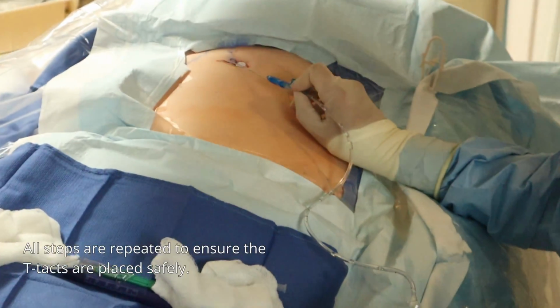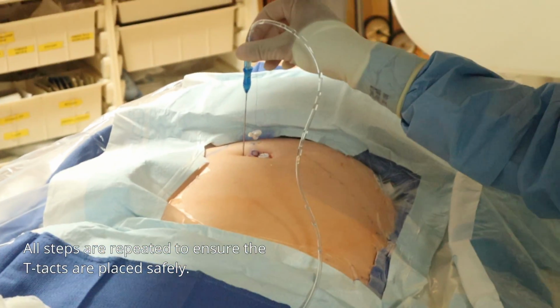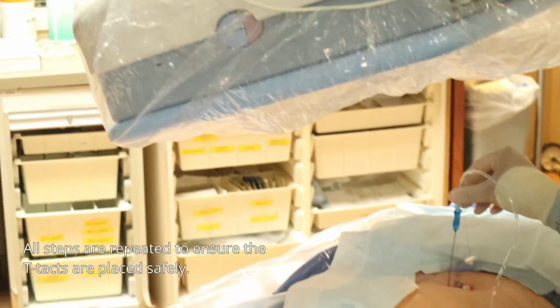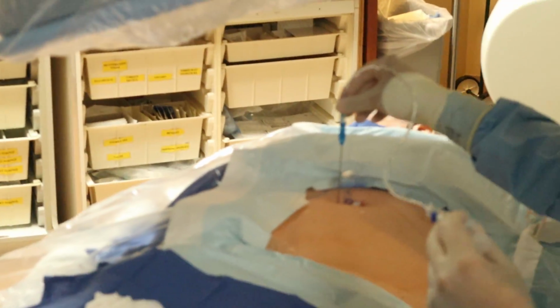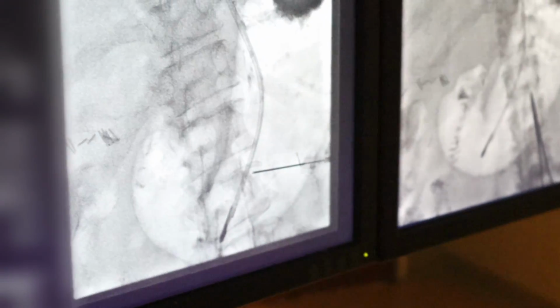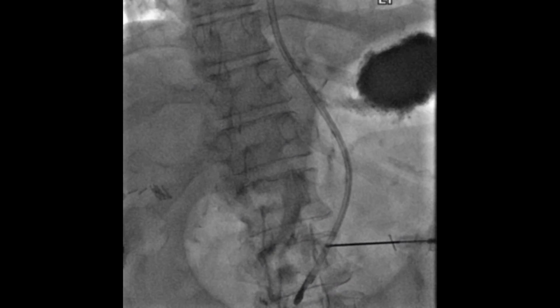So again, over AP, just make sure that you're over the stomach right there. And then we're going to go to RAO 20 again. Alright, so straight down, the same thing. And then my hand is out of the way. Stomach puncture. Air back, syringe, and then inject contrast into the stomach.